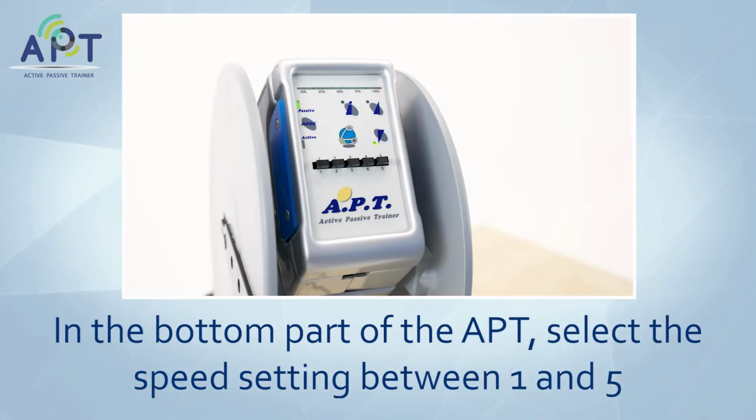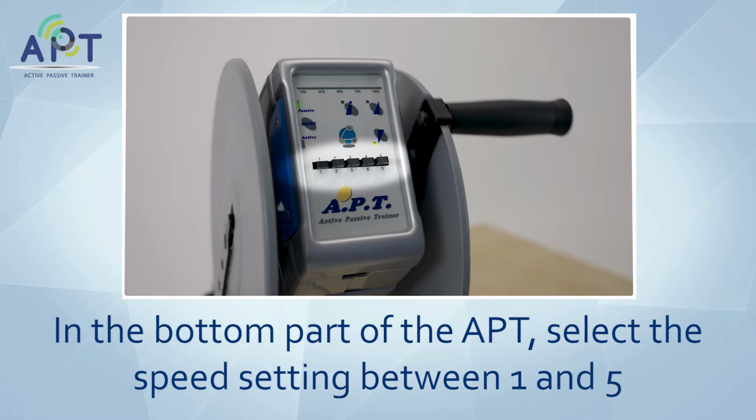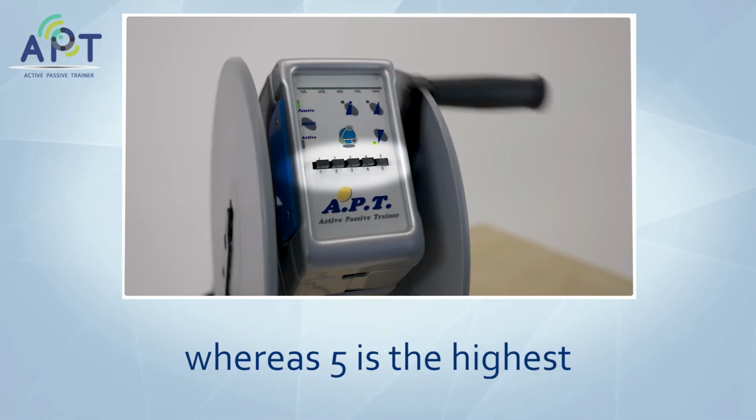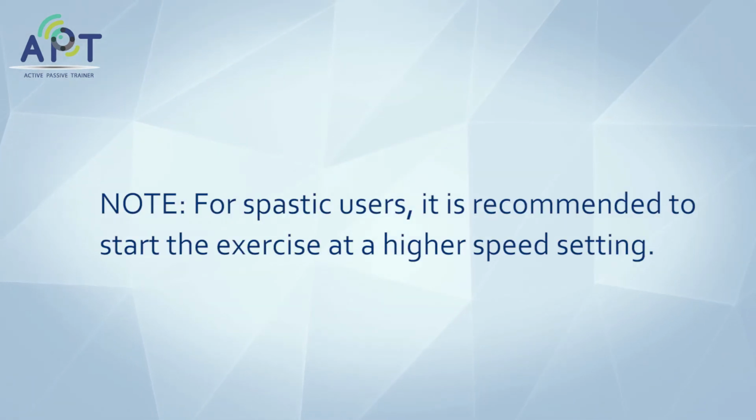In the bottom part of the A.P.T, select the speed setting between 1 and 5. Setting 1 is the lowest speed setting, whereas 5 is the highest. Then, select the same speed setting in your app. For spastic users, it is recommended to start the exercise at a higher speed setting.